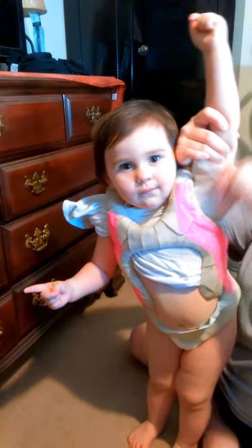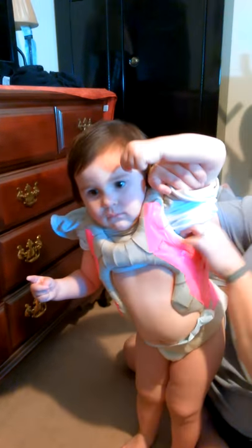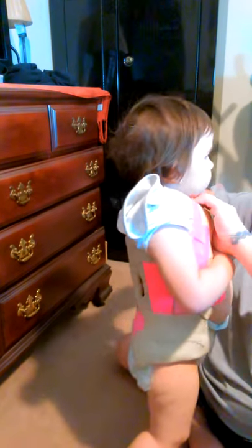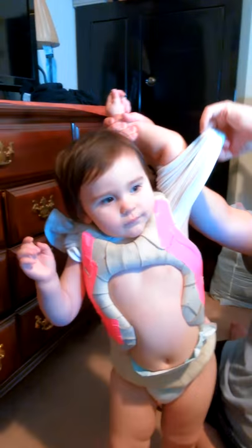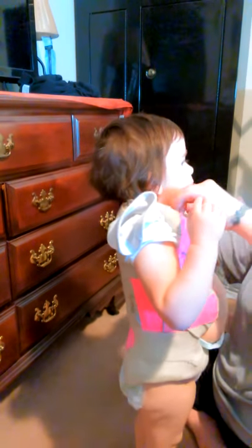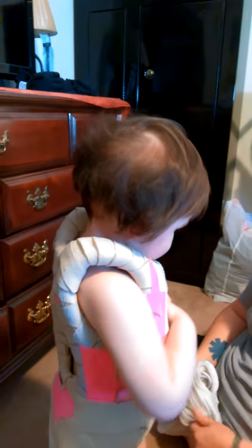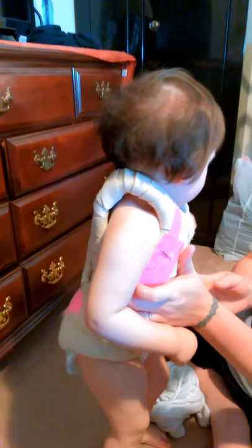Right now we're going to record a video of Judith getting her metacast undershirt changed out. It's also really important not to try and do this within the first couple of weeks, because of the padding and baby squishiness it'll be way too tight — you'd probably get the shirt off but you'd probably never get it back on. Judith has had this cast on for pretty much two months now. This is probably the fourth or fifth shirt change we've done. We didn't change the first one for maybe close to a month because all the padding underneath was very very tight.